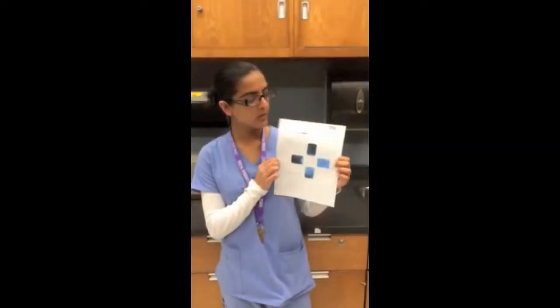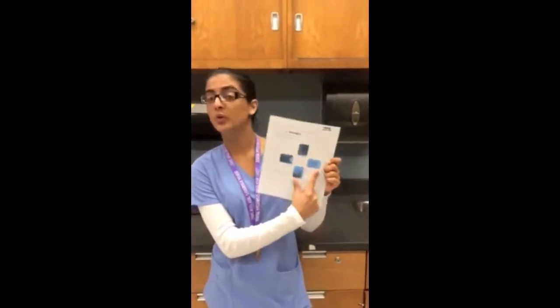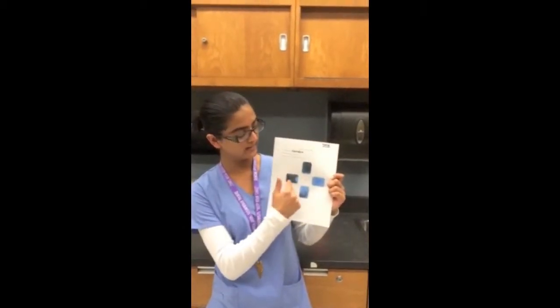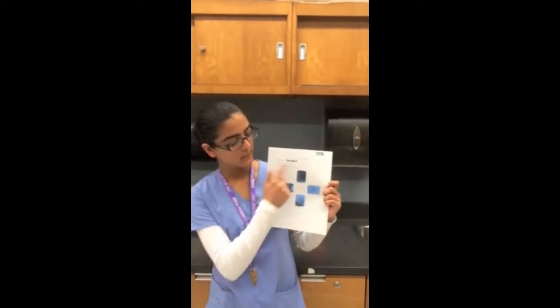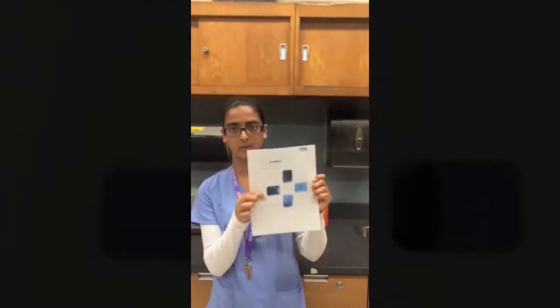So this is the one where we didn't use a collimator of any sort. These are the results that we got. As you can see, these two are manual processing errors; we underdeveloped them. So ignoring those two, you can see that because the beam size with no collimator was increased, it exposed the entire circumference, the entire film got exposed.